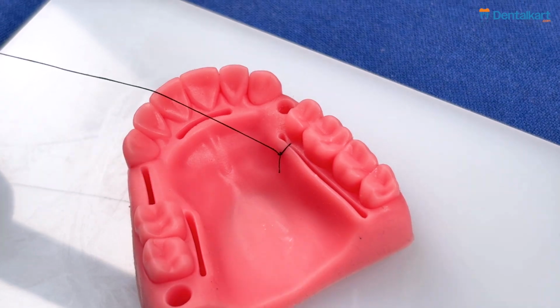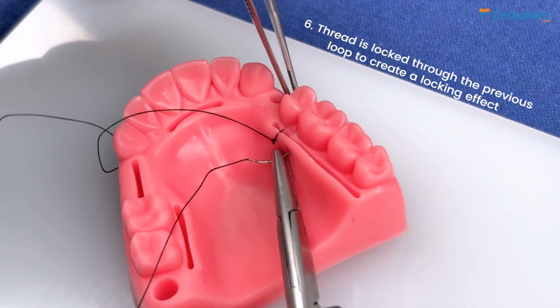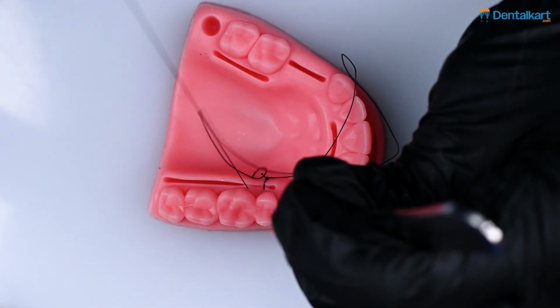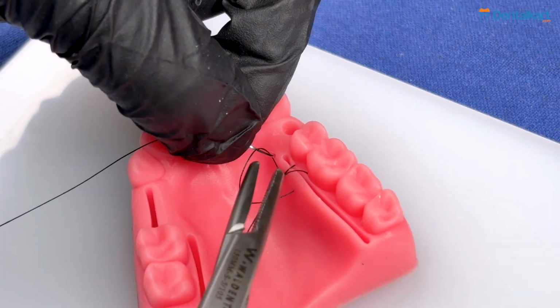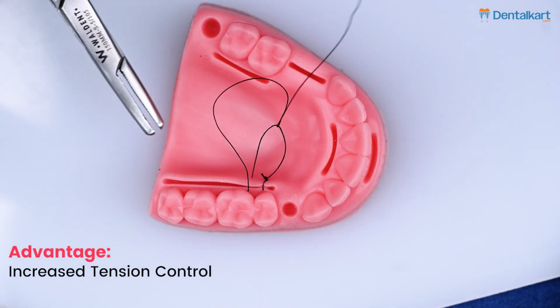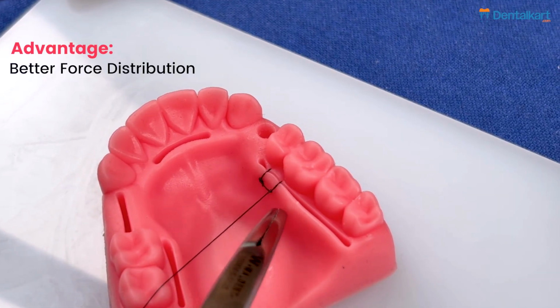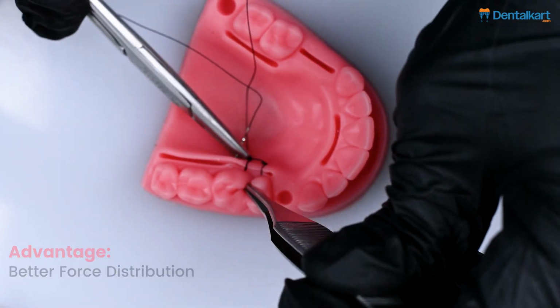The continuous locked suturing is basically a variation in which the thread is looped or locked through the previous loop, and this creates a series of interlocking stitches. It basically allows us increased tension control, which helps to distribute the tension more evenly across the wound edges and prevents the suture line from loosening if one portion breaks.